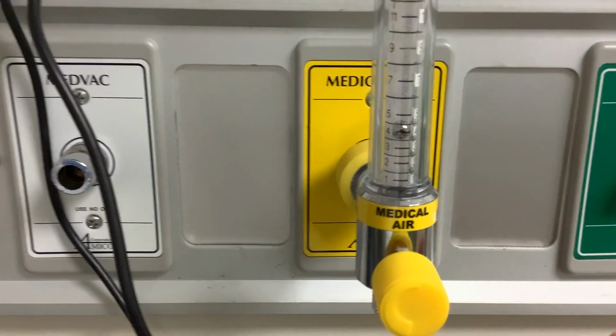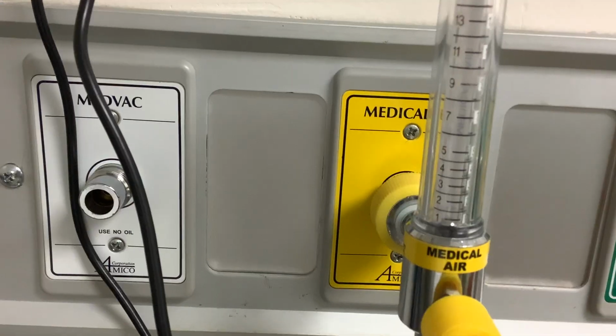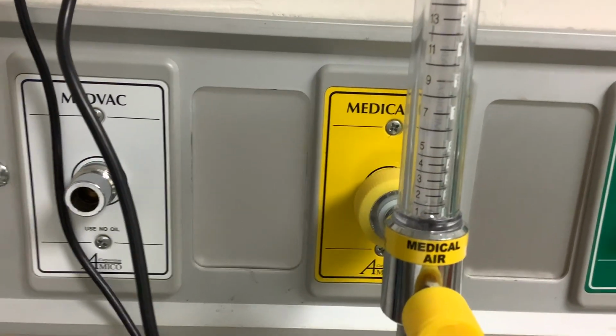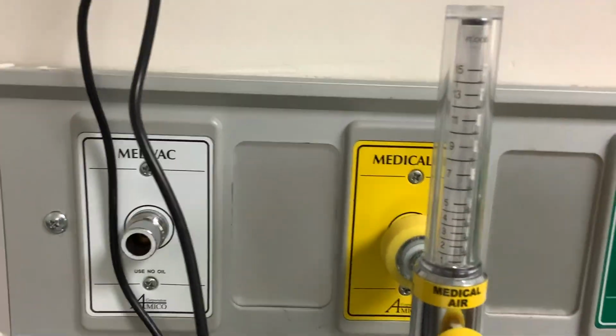If it's a pressure compensated one, if there happens to be a downstream occlusion, then you will see that ball drop. The ball drops so that you know there's no flow going through the system. So that's one way that you can tell if your flow meters are pressure compensated or not pressure compensated.